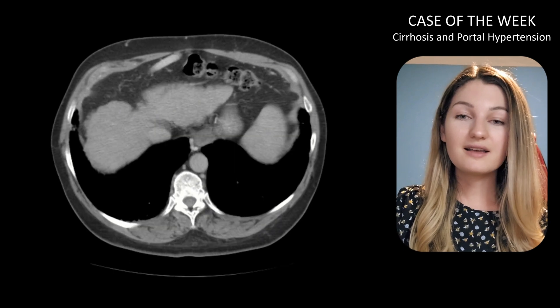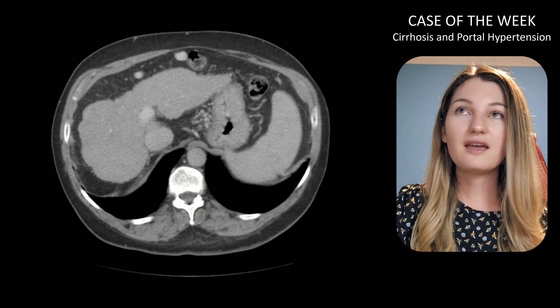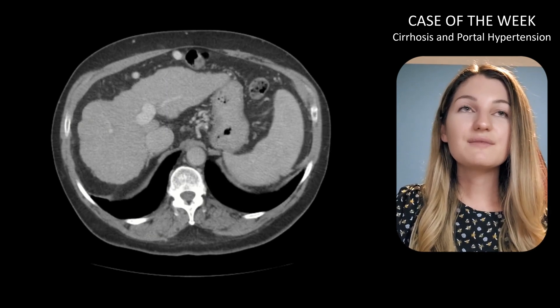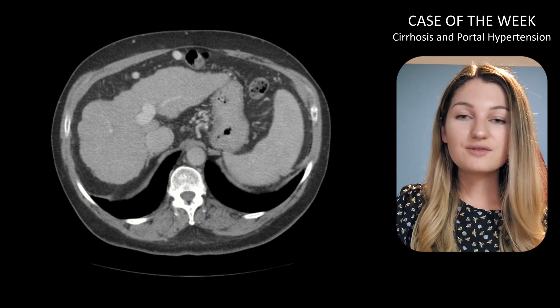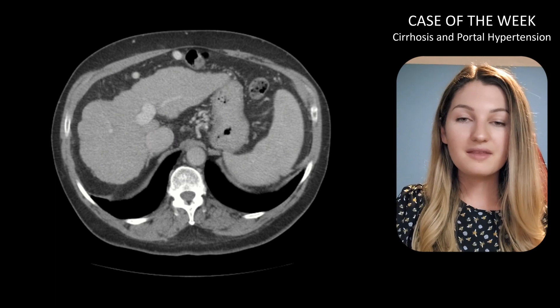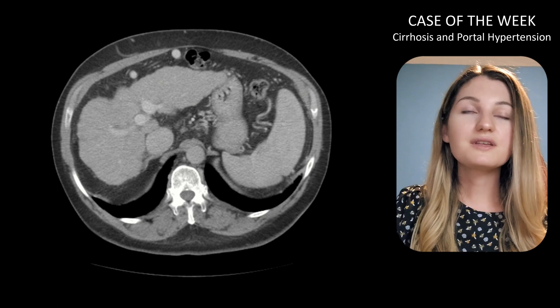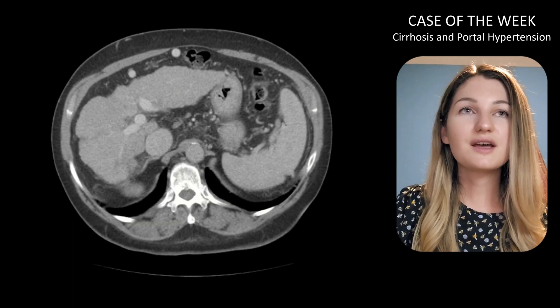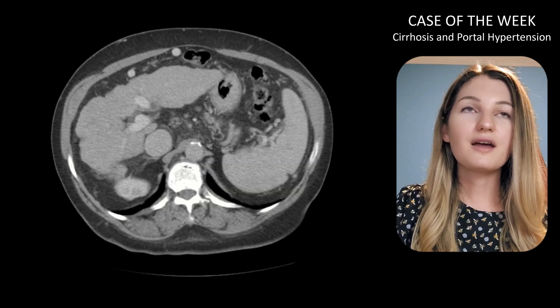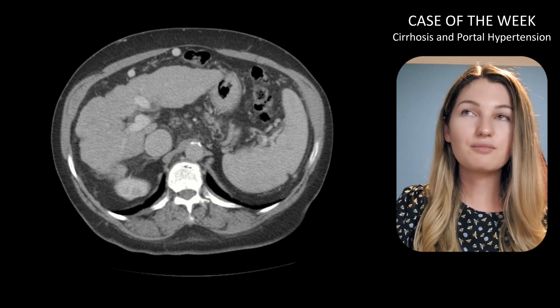The first thing to catch our eye is this very nodular contour of the liver — this is definitely a classic cirrhotic liver. It is a bit atrophic as well, and sometimes with cirrhosis you can see distortion of the normal hepatic architecture. You can see hypertrophy of the caudate lobe and the left hepatic lobe as well as atrophy of the right hepatic lobe. Once you see this classic cirrhotic liver, you know to keep your eyes open for sequela of cirrhosis and portal hypertension.